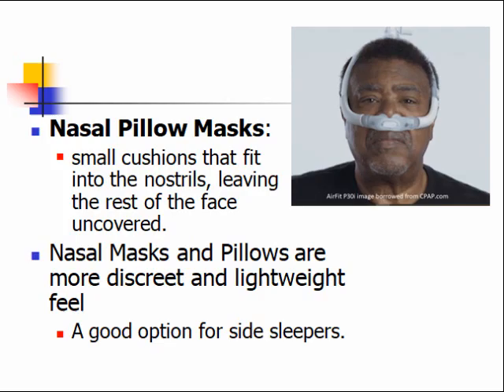These have small cushions that fit right into the nostrils, leaving the rest of the face uncovered. A lot of patients like this better because it feels more open, less claustrophobic. Both nasal masks and pillows are lightweight, they're more discreet, they're less confining, and they're also a good option for patients who like sleeping on their side.